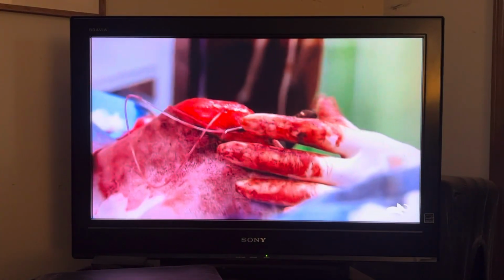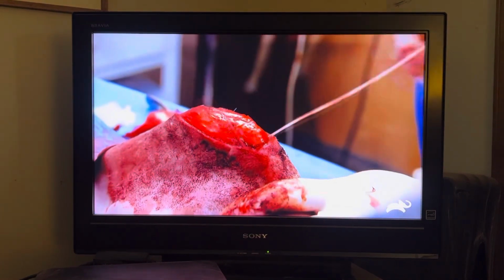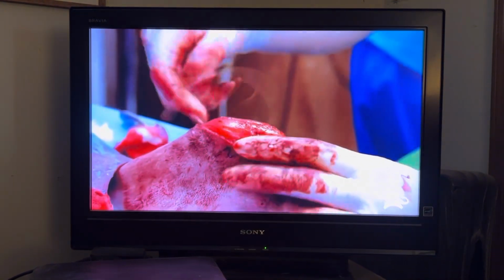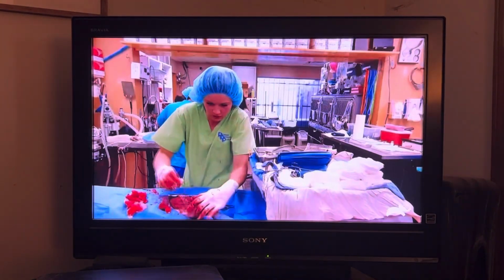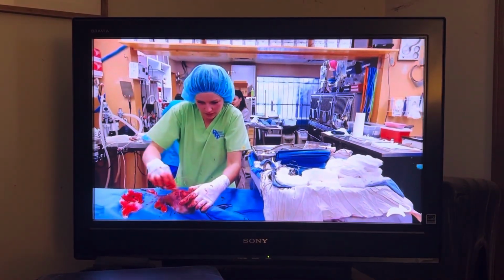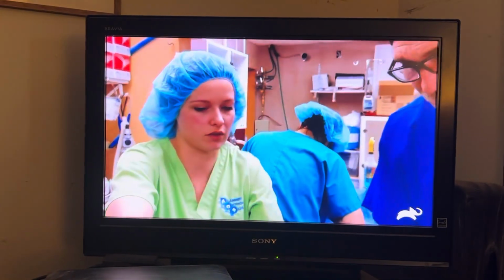So this is how I'm passing it through, using this needle with the hole in it, and that pulls it right through. I'm just making sure it's got normal range of motion. One thing that's hard is making sure you place that right, so I might have Jeff check that. You want to check and make sure? Sure. I guess I should have maybe, I don't know, maybe I shouldn't have.